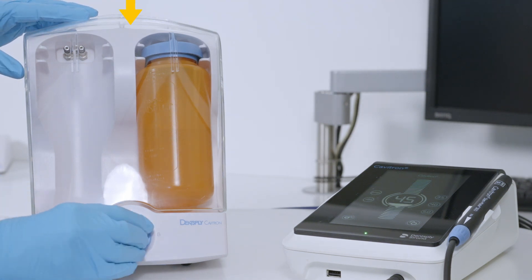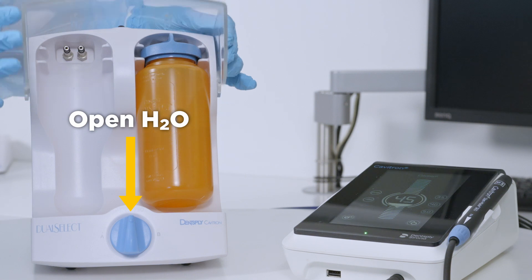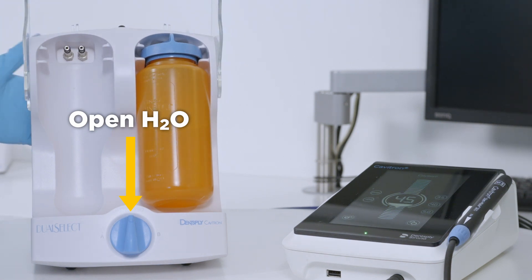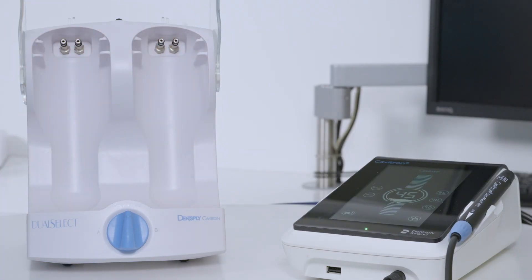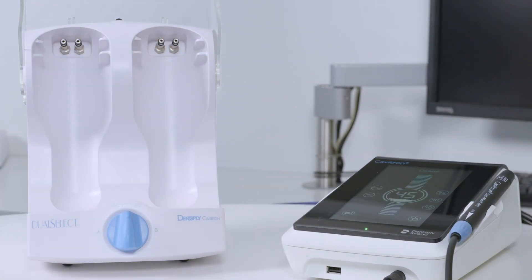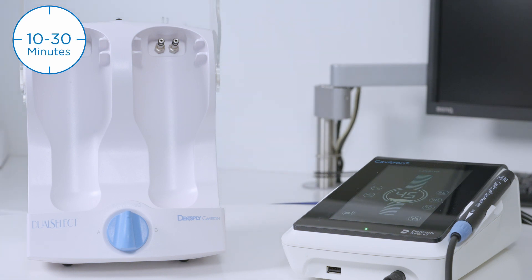Set the selector knob to open H2O position, open the shield, and remove the disinfectant bottle. The system should be left undisturbed, allowing the prepared solution to sit in the water line for a minimum of 10 minutes, but no more than 30 minutes.